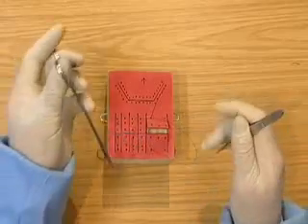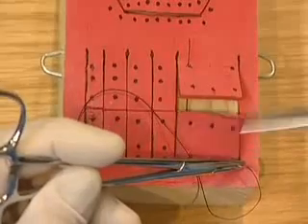Turn the needle around as we're going in a reverse direction. Change to the pen grip, going in, and unlock.